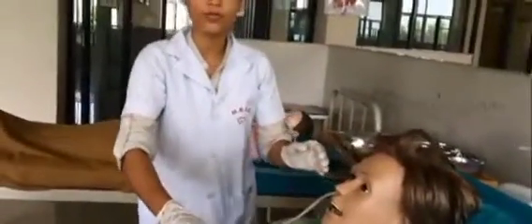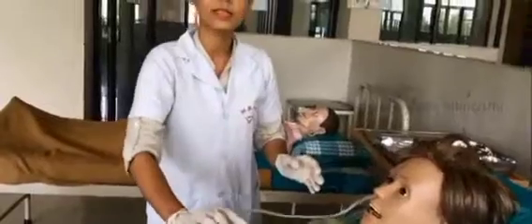After the insertion, now we have to see the placement of the NG tube, whether it is in the stomach or not.